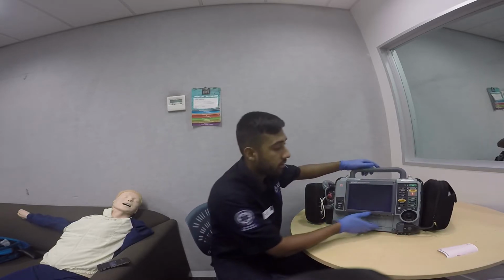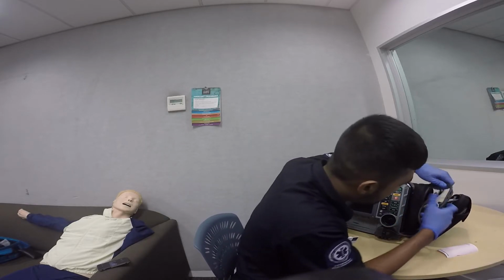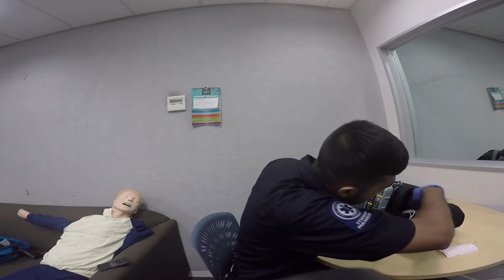On the opposite pocket, we've got a 12-lead ECG with connector dots. We've also got a test probe and some spare connector dots as well. So I'll take our test probe out.